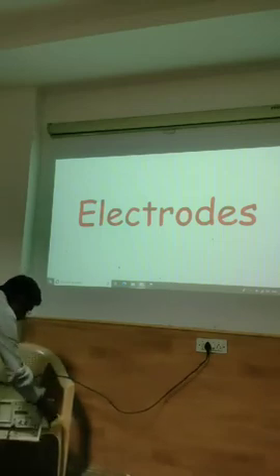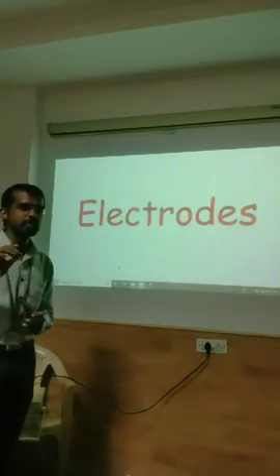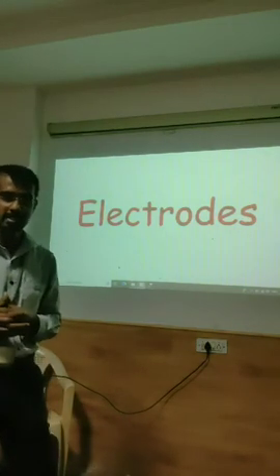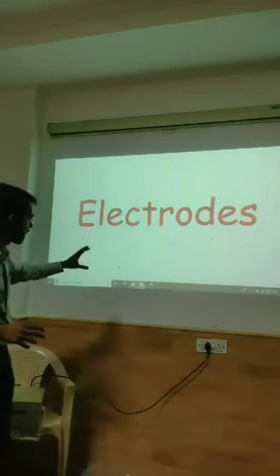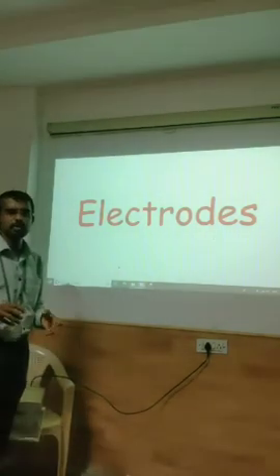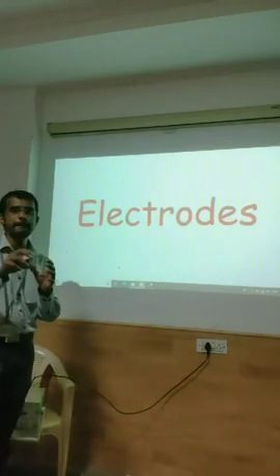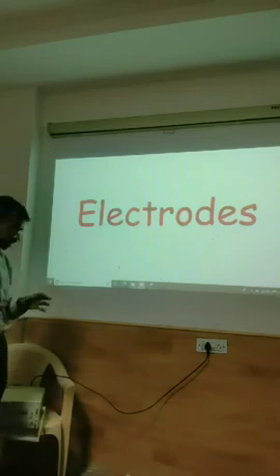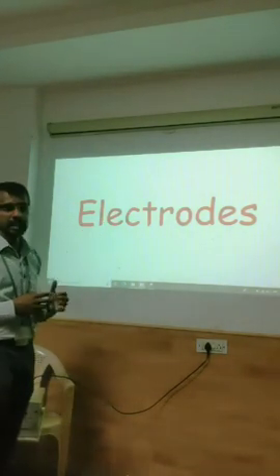So that is the basic measurement, right? Now if I ask you where the signal exactly came from, nobody has an answer. It could be from my hand or from anywhere in the body. So that makes the need for electrodes. Also, the signal was almost like a noise signal. We were not sure about the pattern of the signal, the wave shape of the signal. These are all the troubles we have when we go for a rough measurement. That is why we need electrodes here.